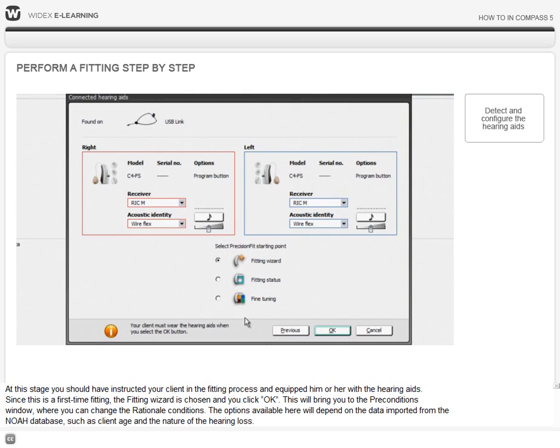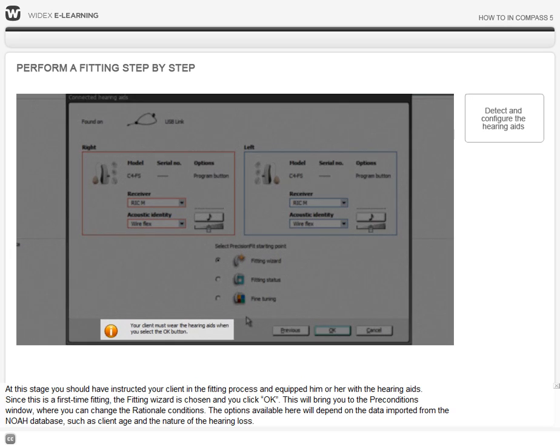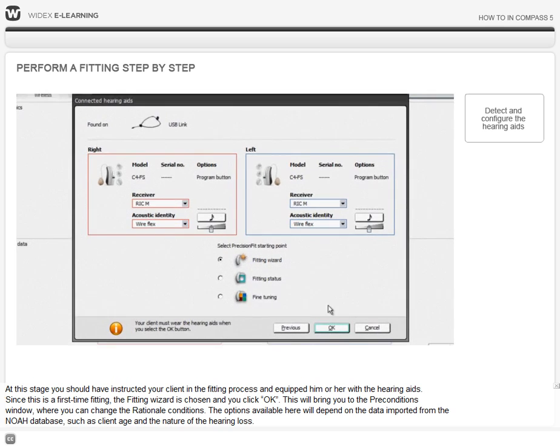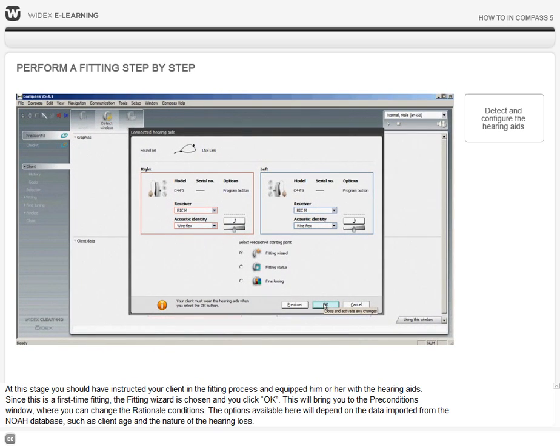At this stage, you should have instructed your client in the fitting process and equipped him or her with the hearing aids. Since this is a first-time fitting, the Fitting Wizard is chosen and OK is clicked.